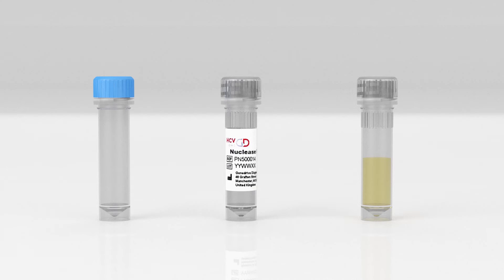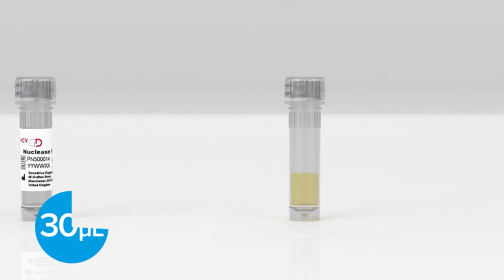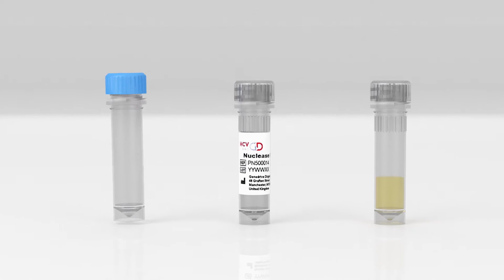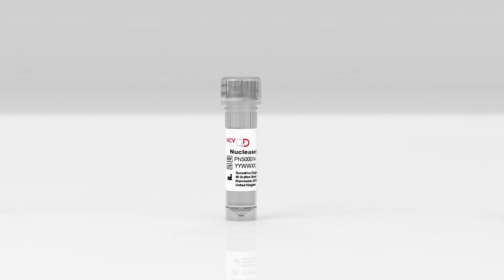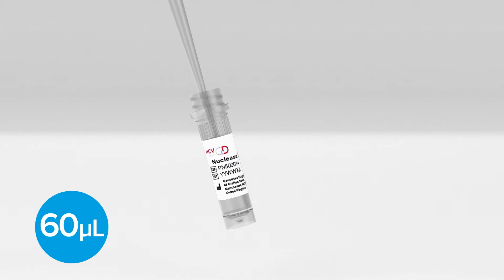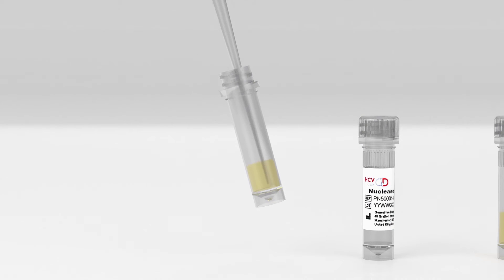Take the empty tube, the nuclease-free water, and the plasma sample. Mix the plasma sample thoroughly by pipetting up and down at least 10 times. This ensures an even mix of virus particles if present. Next, transfer 30 microlitres of the plasma to the empty tube provided, followed by 60 microlitres of nuclease-free water to dilute the plasma. Mix thoroughly by pipetting up and down at least 10 times.